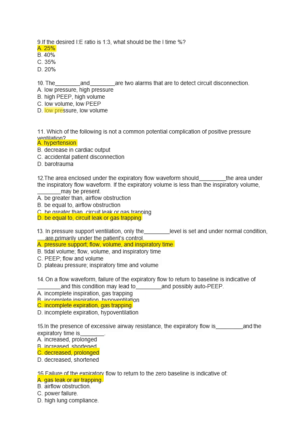10th question, the dash and dash are two alarms that are used to detect the circuit disconnection.